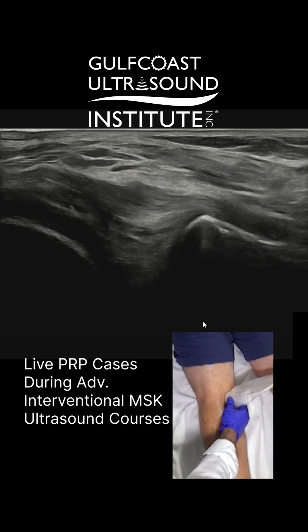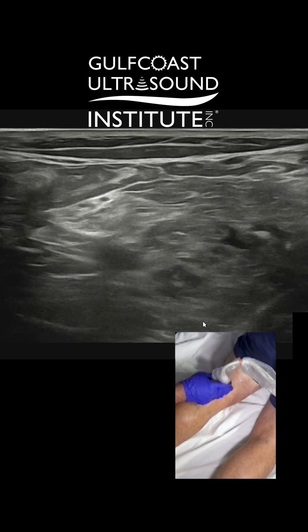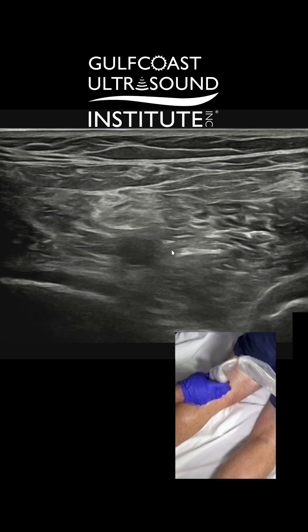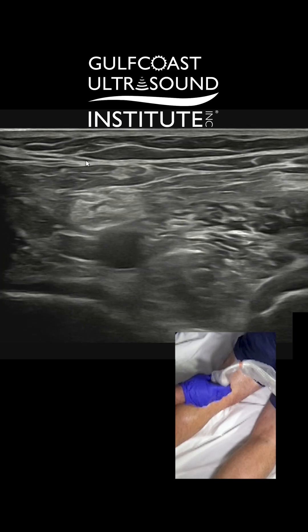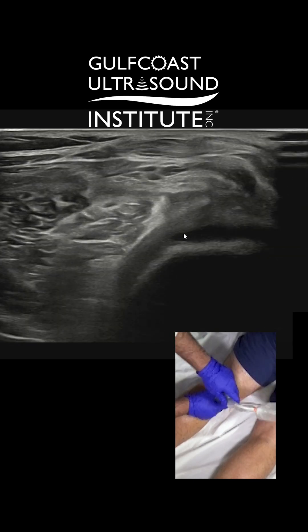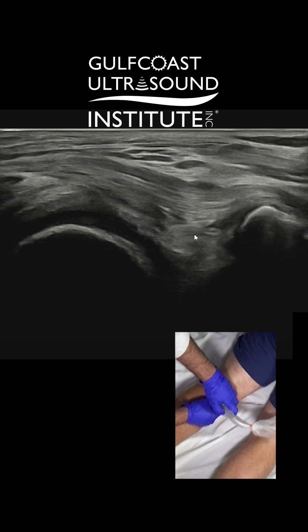So then we're going to come in and inject this. You want to be aware of the neurovascular structures here. Let's find these right here — we want to make sure we're not anywhere near that. There are our structures, there's our medial femoral condyle, which is kind of one of our landmarks. And there's our semimembranosis with the posterior horn.